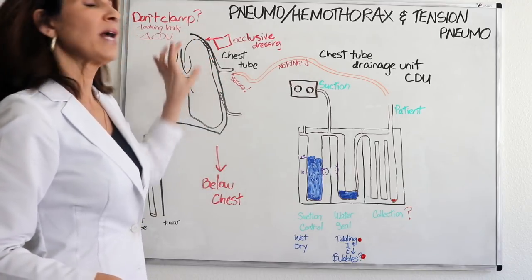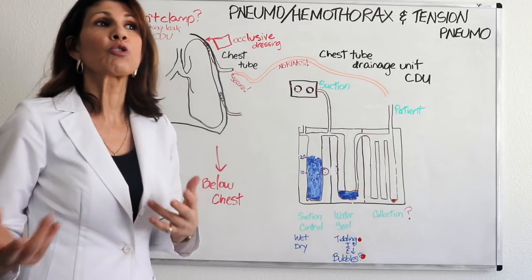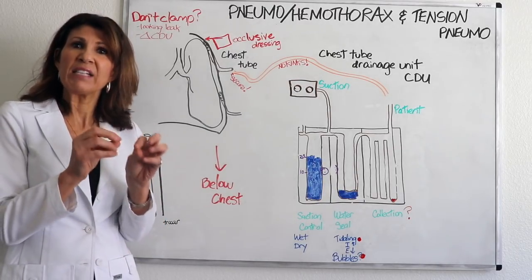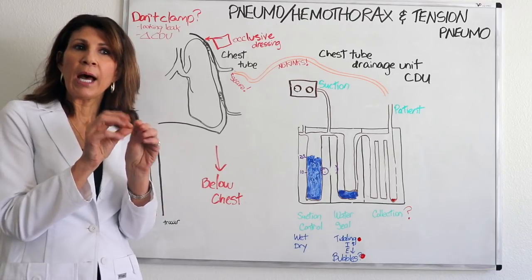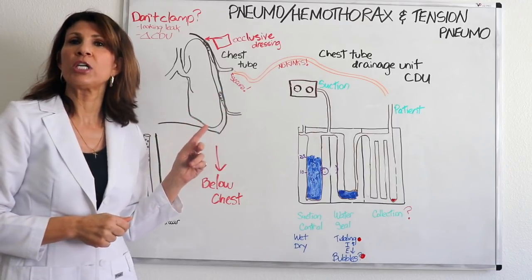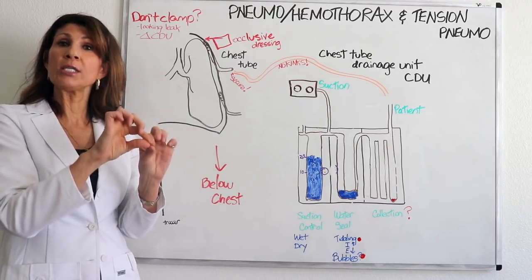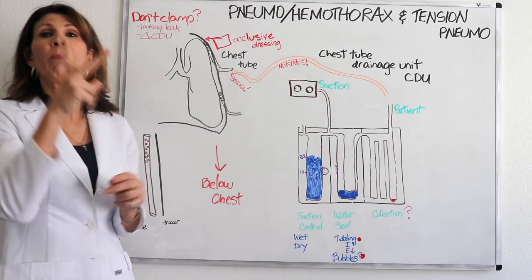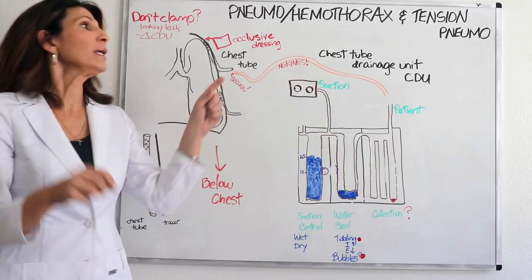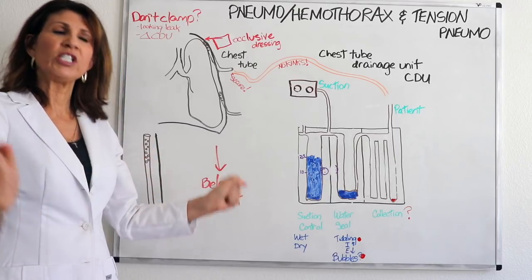The next thing that goes at that insertion site is what's called Vaseline gauze, or Vaseline petroleum gauze. It's also called xeroform gauze, and that's just what it is. It's Vaseline petroleum jelly stuck to a little piece of gauze that allows for an occlusive seal around this chest tube site. And then on top of that, put 4x4s, or one of those trach gauze, meaning it has a slit in it, and that slit will allow the gauze to surround that chest tube. This way you allow for a nice occlusive seal with that stretchy tape over it.